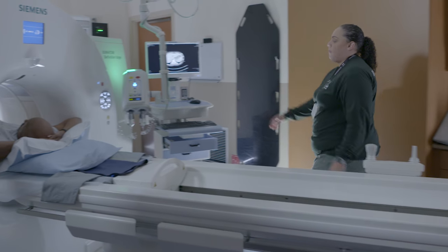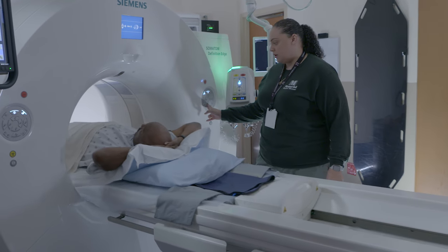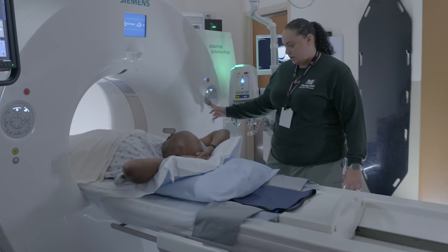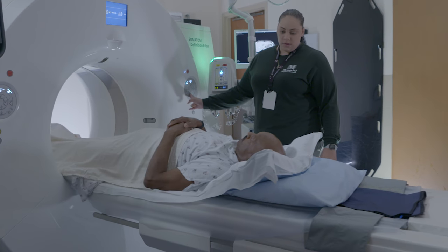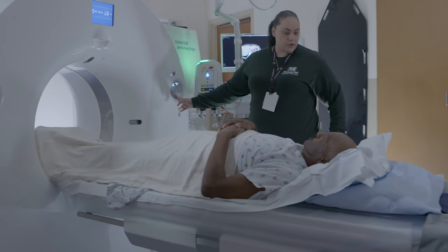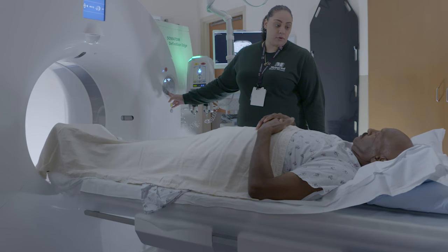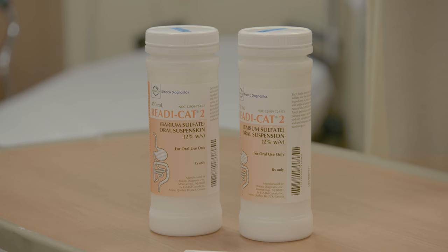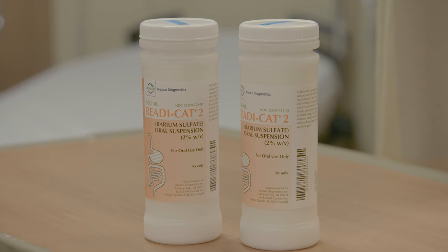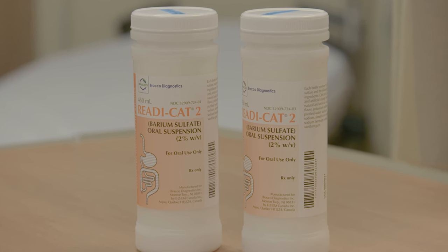The entire appointment will take up to 30 minutes. Once the images are complete, the procedure is over. You can get dressed and resume your normal day. If you use the oral contrast, you will be asked to drink plenty of water and fluids to avoid any stomach discomfort. Oral contrast can cause your stool to come out white or gray as it's being eliminated by your body. This is completely normal.